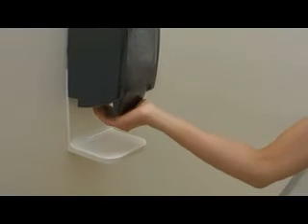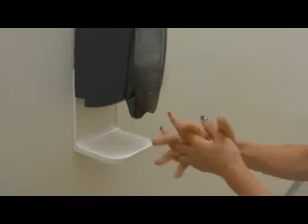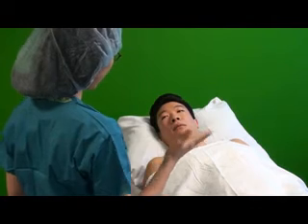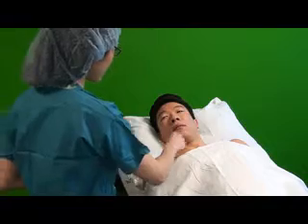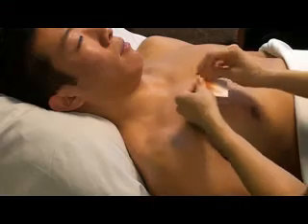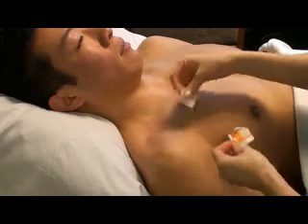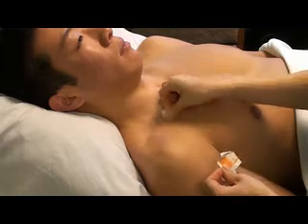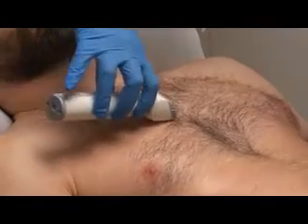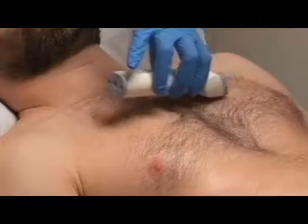Wash or sanitize your hands before entering the room and starting the procedure. If the patient is conscious, explain the procedure before proceeding. If needed, use an alcohol wipe to remove excess oil from the skin to improve the electrical conductivity. If the patient is hirsute, consider shaving the skin in the areas where the electrodes will be placed.